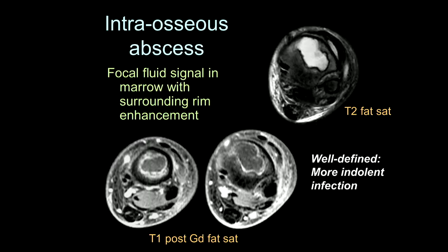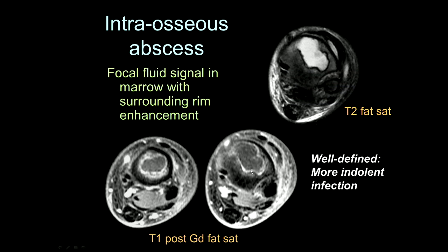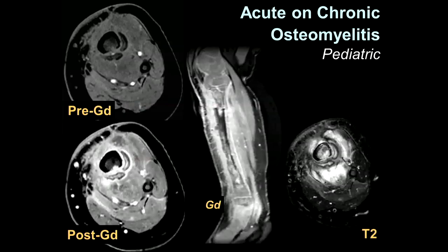These abscesses can become more chronic, and when they become more chronic, they become less inflammatory. The body walls off the infection, leading to an appearance of fluid signal inside the bone, usually at the metaphysis. If you give contrast, you'll see thick rim enhancement again. In this situation, if there's no clinical history provided, this could look like a tumor. But you have to consider the possibility of an intraosseous abscess, especially in the susceptible population.